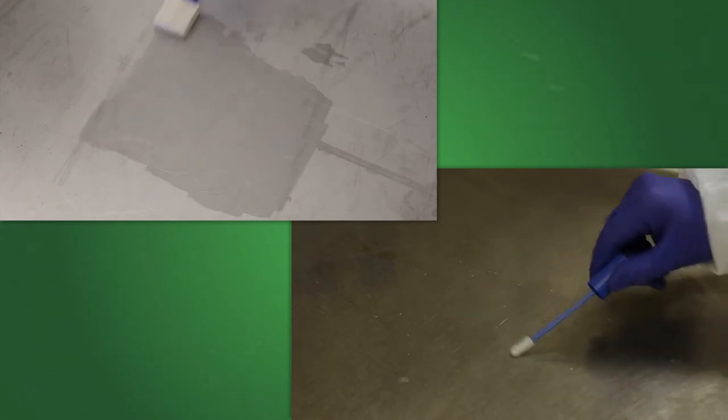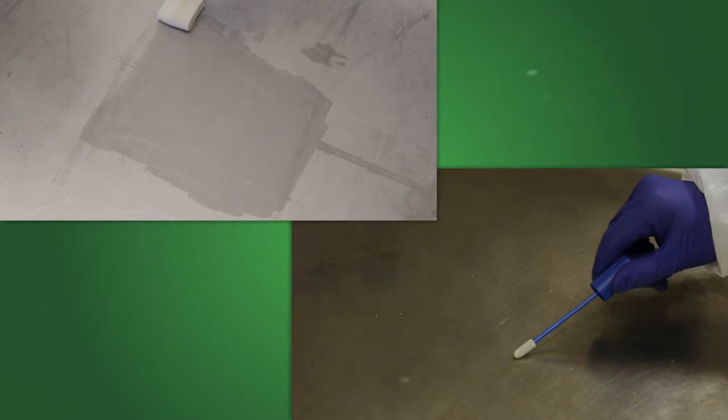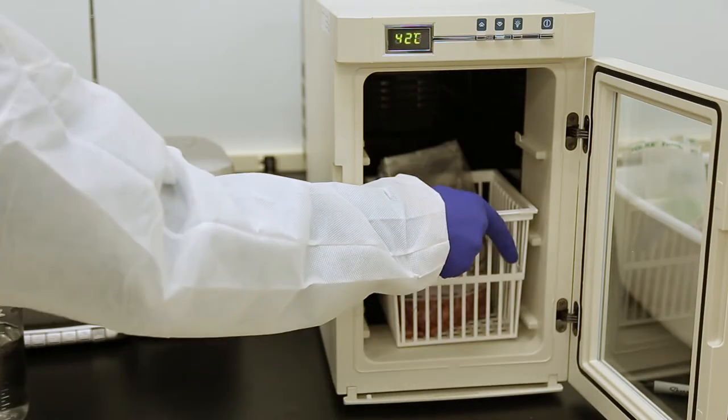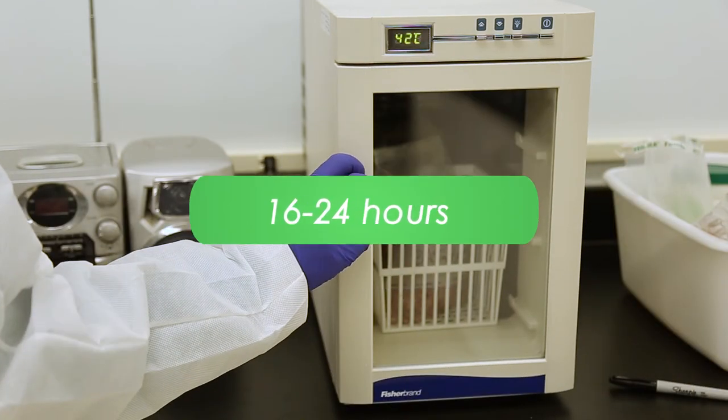For sponges, 100 milliliters of media is recommended. For swabs, 10 milliliters of media is recommended. These should be incubated at 42 degrees Celsius plus or minus one degree for 16 to 24 hours.